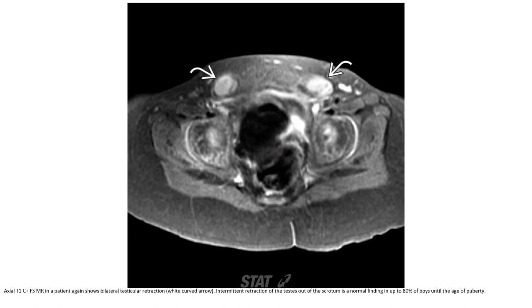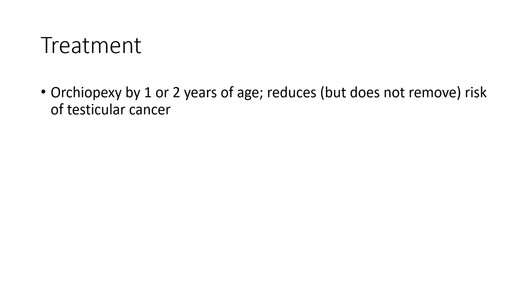T1 with fat suppression MRI in the same patient shows bilateral testicle retraction. Intermittent retraction of the testis out of the scrotum is a normal finding in up to eighty percent of boys until the age of puberty. Treatment — orchiopexy by one or two years of age — reduces the risk of testicular cancer.